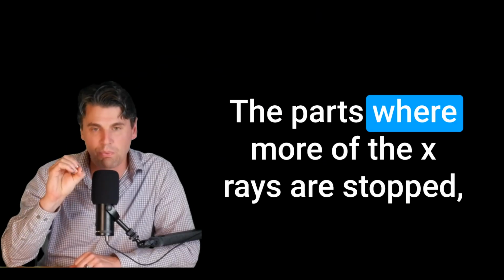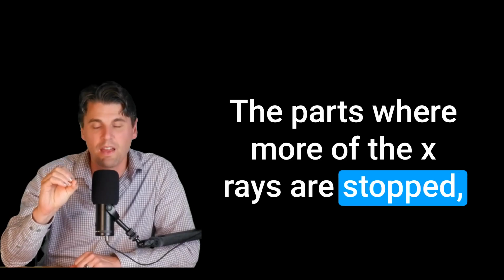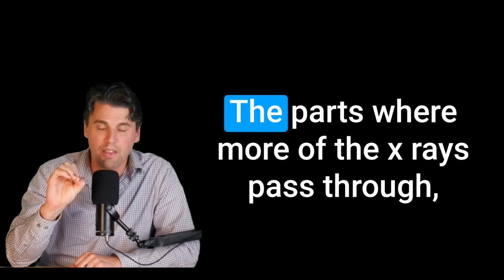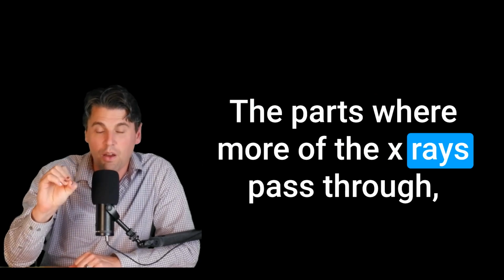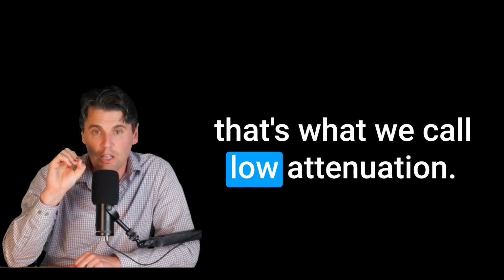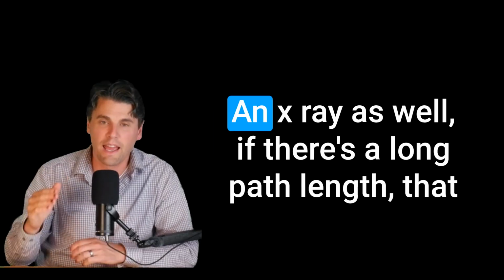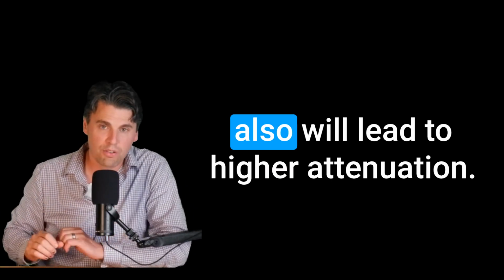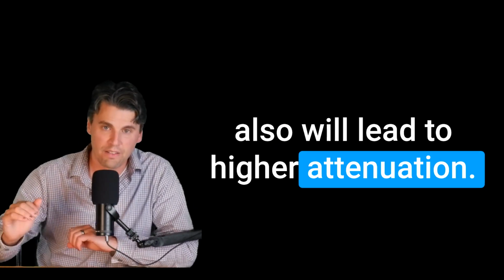The parts where more of the X-rays are stopped, that's what we call high attenuation. The parts where more of the X-rays pass through, that's what we call low attenuation. In X-ray as well, if there's a long path length, that also will lead to higher attenuation.